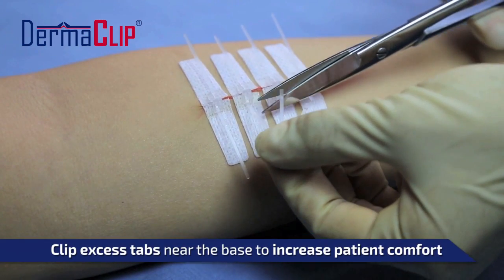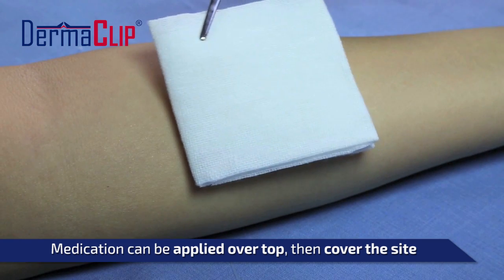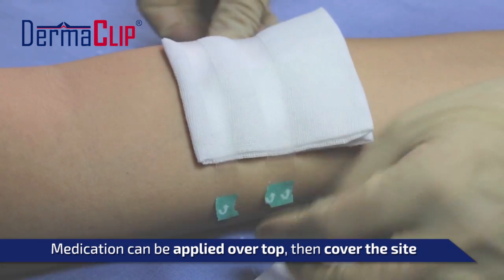Once all of the devices are closed, it is recommended that the excess tabs be cut off for patient comfort. Medication can be applied once the devices are firmly on the skin. Additionally, it is advised to cover the closed wound site according to your general standards for recently closed wounds.